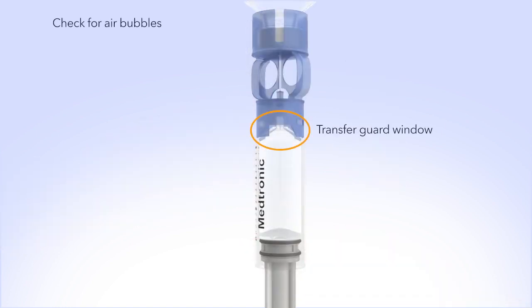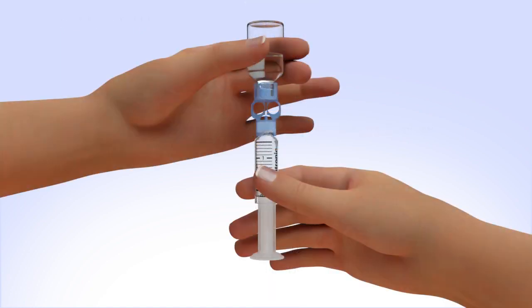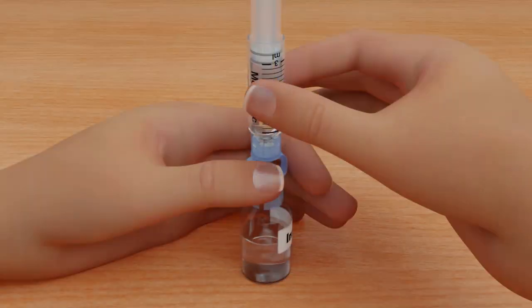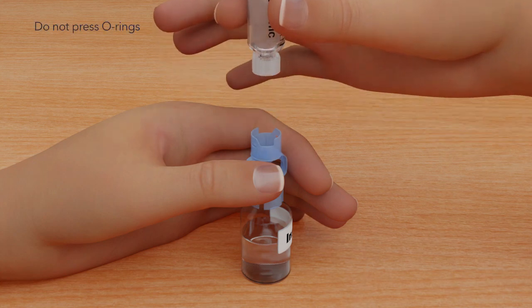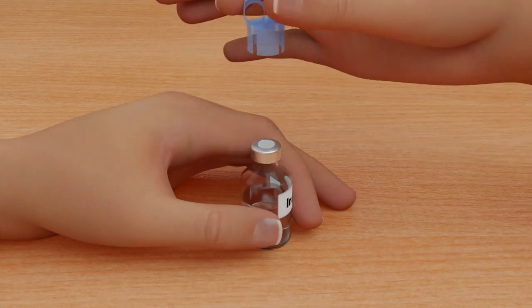Look in the window of the blue transfer guard to make sure no air bubbles remain. To avoid getting liquid on the top of the reservoir, flip the vial over so it is upright. With the vial down on the table, hold the transfer guard with one hand. With your other hand, turn the reservoir counterclockwise and then pull straight up to remove it from the transfer guard. Be careful not to press on the o-rings. Disconnect the transfer guard from the vial and dispose of it properly.